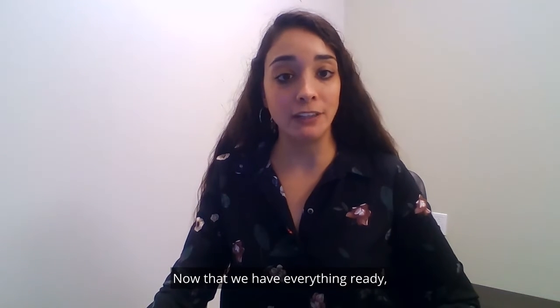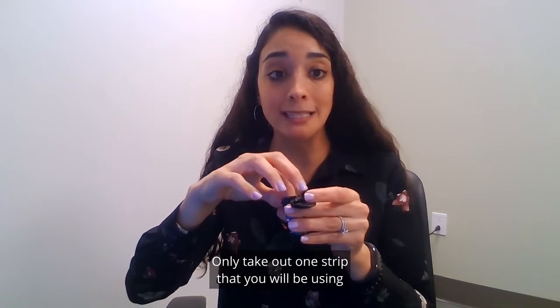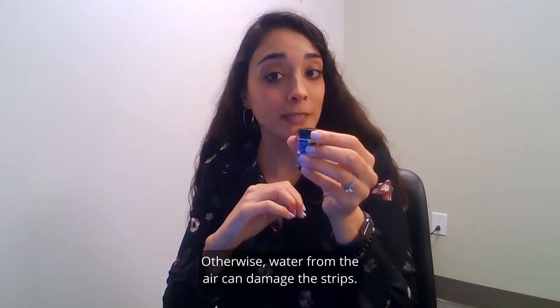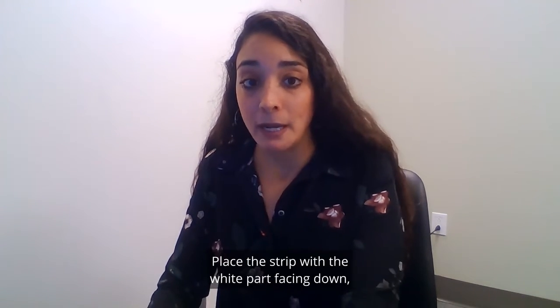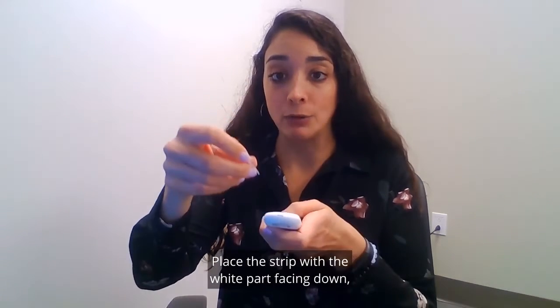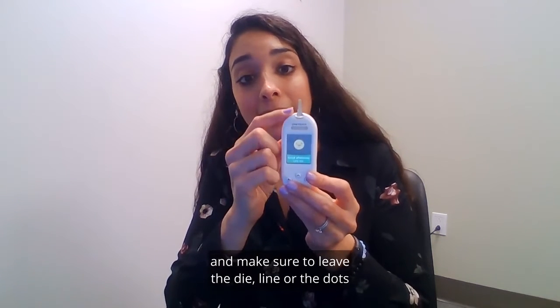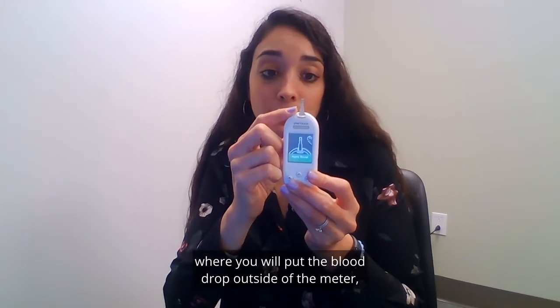Now that we have everything ready we will put the strip in the meter to turn it on. Only take out one strip that you will be using and close the box for the strips, otherwise water from the air can damage the strips. Place the strip with the white part facing down as you will be looking at your meter, and make sure to leave the line or the dots where you will put the blood drop outside of the meter.